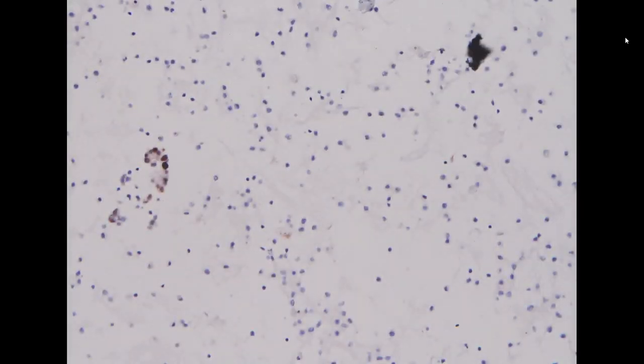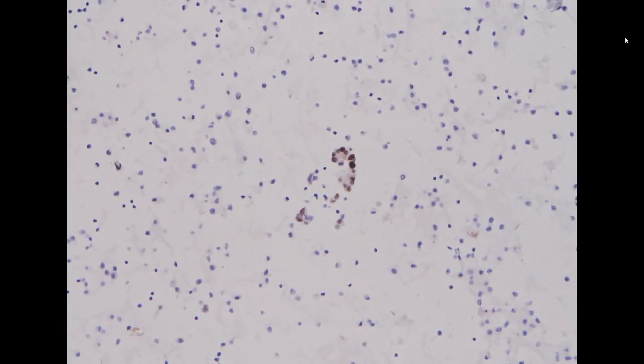However, in our practice as a tertiary hospital, it was always very complicated. So we have seen a couple months ago a patient with thymic carcinoma, but who developed a mesothelioma after that. So we will do a BAP1 to confirm there's no BAP1 loss for this case, because we've seen so many strange cases that you cannot imagine.